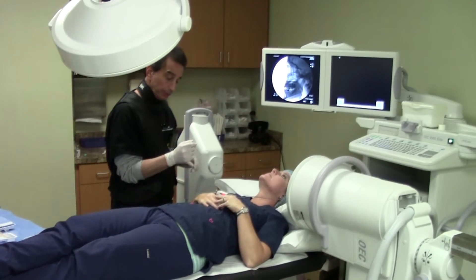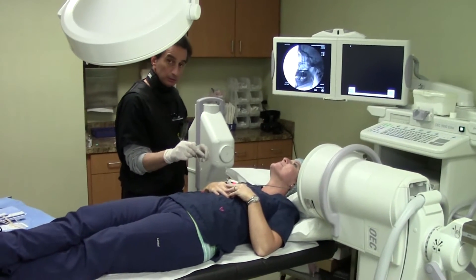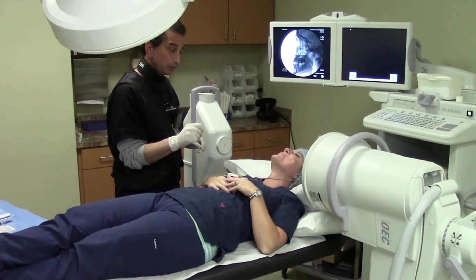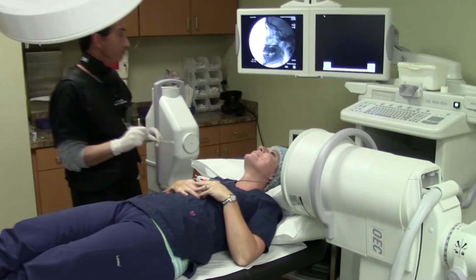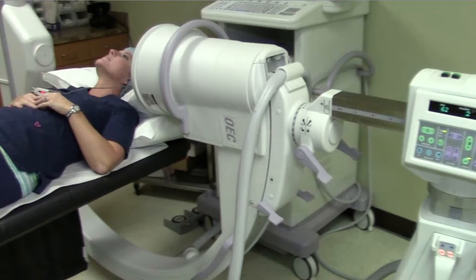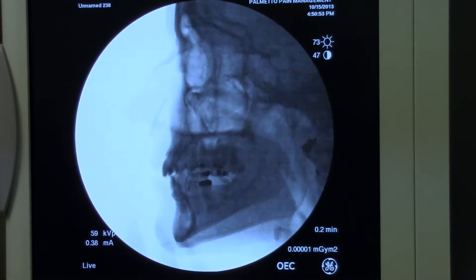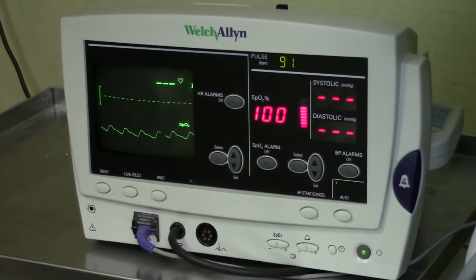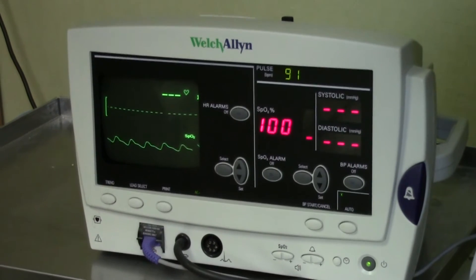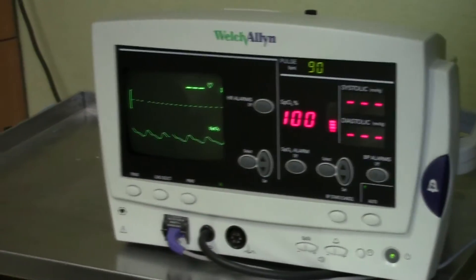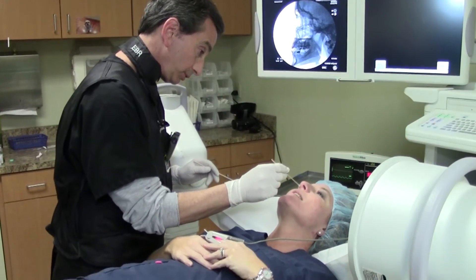We have the patient lying supine on the procedure table. The C-arm is positioned for a lateral view, and we are monitoring her with a pulse oximeter.